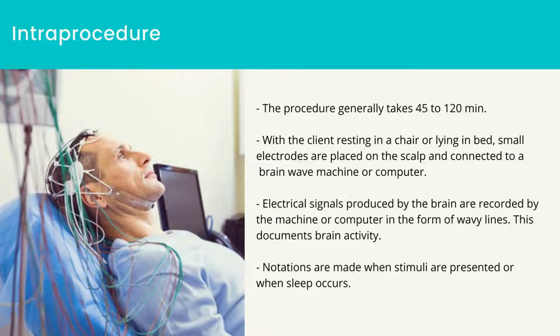Avoid taking any stimulant or sedative medication 12 to 24 hours prior to the procedure. Intra Procedure. The procedure generally takes 45 to 120 minutes. There are no risks associated with this procedure.